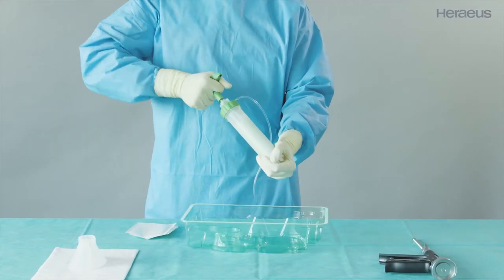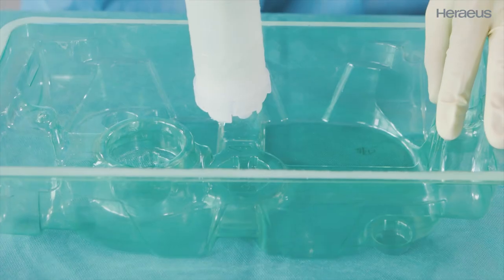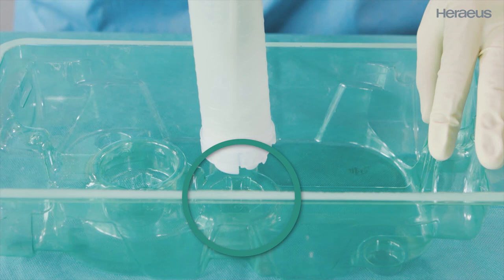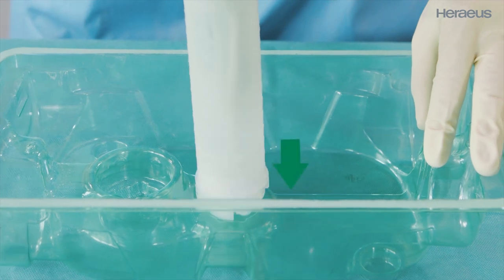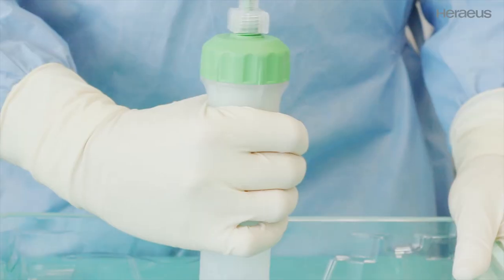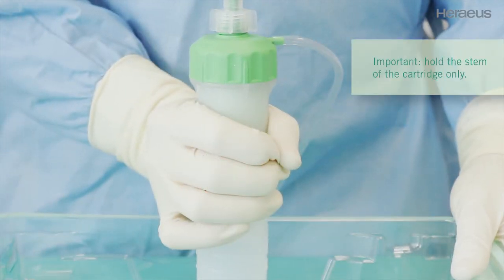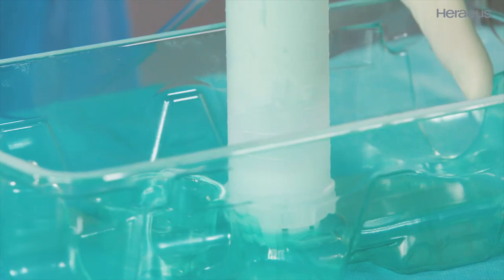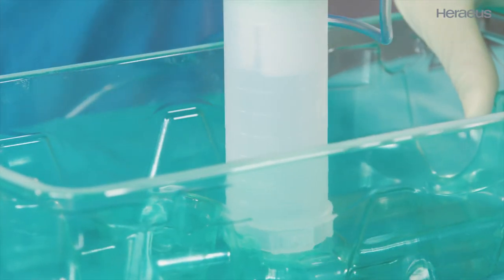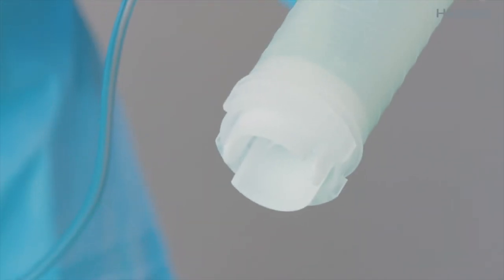Retract the mixing rod as far as the stop and briefly rotate it to the left and right. Place the cartridge in tray station 2 without applying force and rotate it to collect the mixed cement under vacuum. When rotating, hold the stem of the cartridge, not the cap. The cartridge base is then released and moves upward rapidly under vacuum, collecting the bone cement in the cartridge.